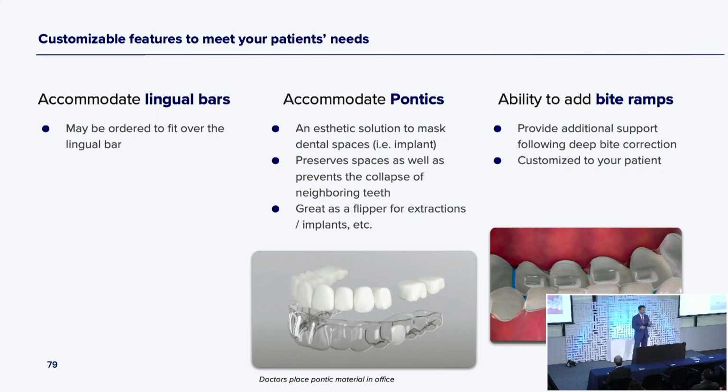Thank you for bringing your retainers, because you run in the back and you squirt the white PVS in there, and then you can just remove the tooth to the gum line, and you put the retainer right in. You have an instant flipper. It takes you 5 minutes to deliver a flipper for a broken tooth. Run over to the periodontist, or if you're doing it, extract, graft, implant, and now they have their retainer for social settings. It's a beautiful thing to wear socially in case they're missing a tooth.